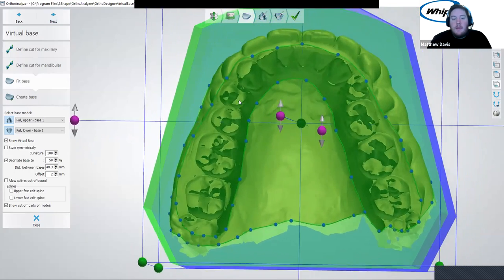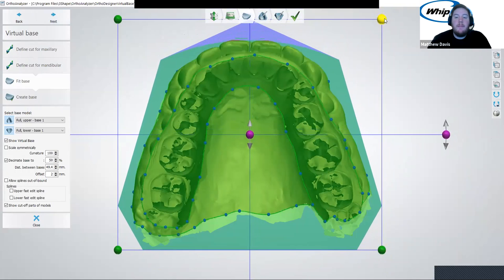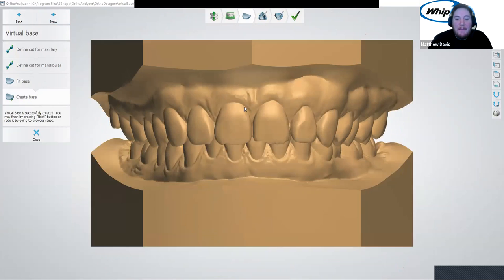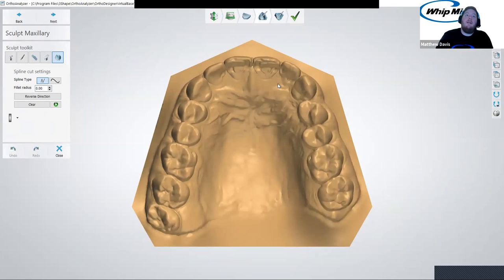It'll calculate and there you go — you have some models. Technically they are printable, but we don't want to waste all this material just on a base. I'm going to demonstrate this toolkit and how to clean these up so you can have shorter models that are printed just for, say, a suck-down Essex retainer or a Hawley retainer. A really common prescription a doctor will give is an upper Hawley retainer and a lower Essex retainer. I'm going to showcase how you would do that.